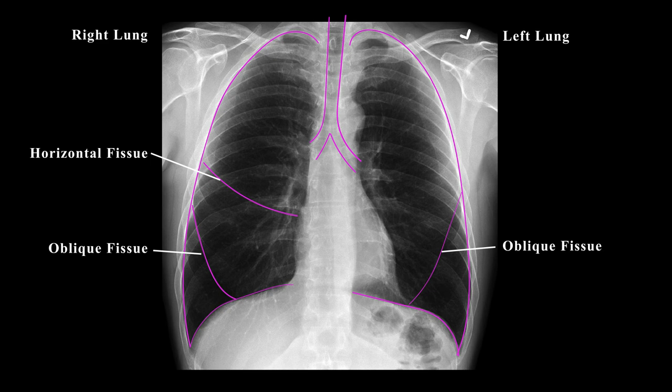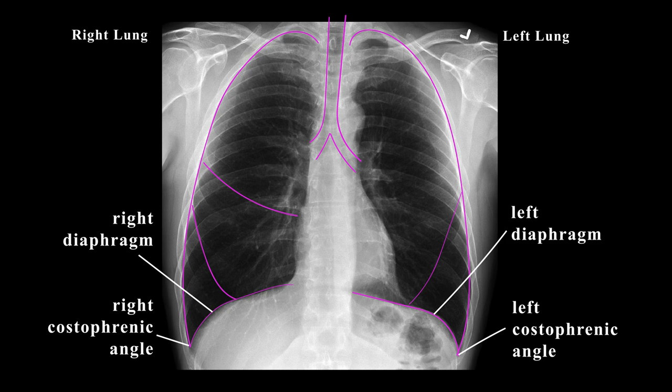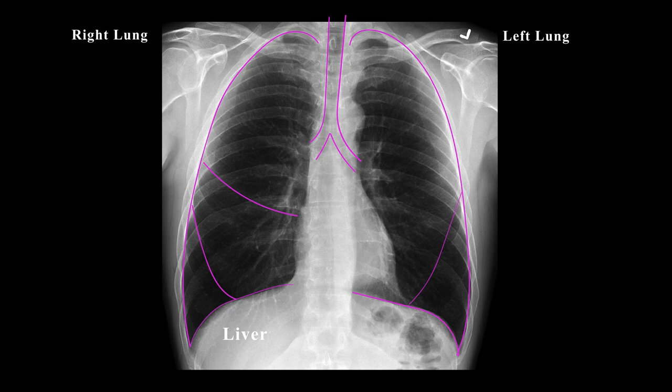When assessing the lungs, I also look at the surrounding pleura and then the diaphragms on both sides. The diaphragms should have a curved shape to them and sharp costophrenic angles. The right diaphragm should be higher than the left because of the liver, and on the left, sometimes you could see a gastric bubble underneath the left diaphragm.